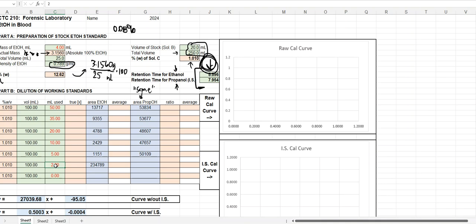And then it went to 2 mils. And then it went to 234,000. Sorry, this person just did not know what they were doing. They got confused. They added the wrong stuff. I don't know what they did. But it is clearly not made the appropriate way.